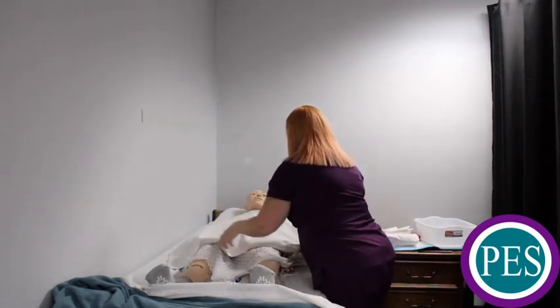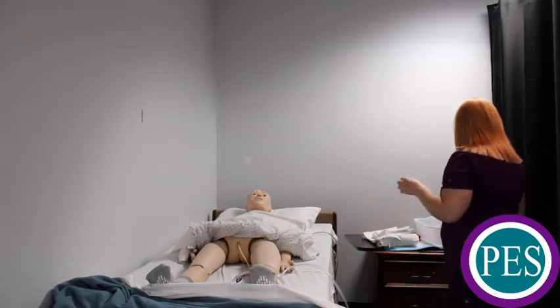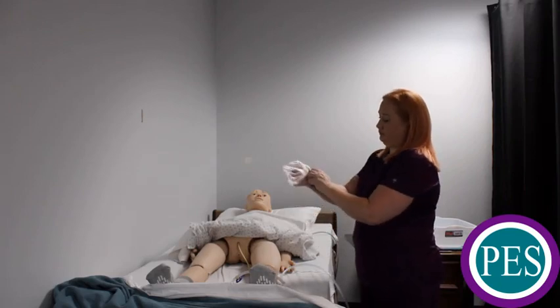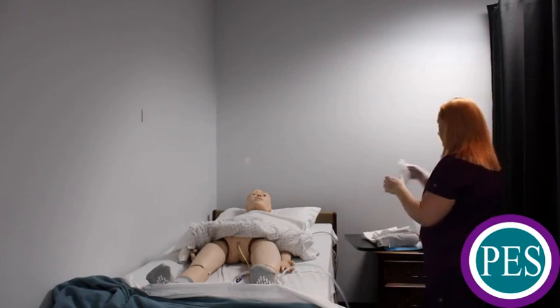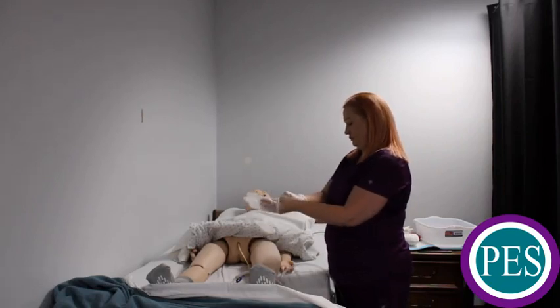Prepare your resident by covering the resident with a bath blanket and providing privacy by closing the curtain for this task. Remember when exposing the area surrounding the catheter that you're only exposing the lower half of the resident's body. Put on your gloves.